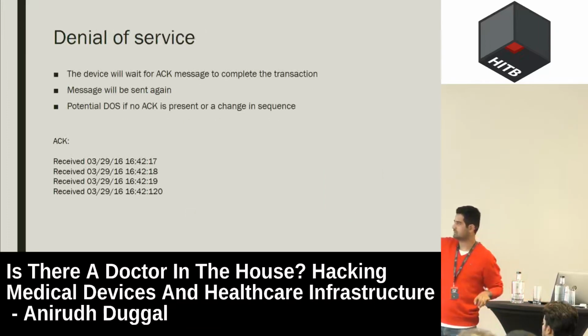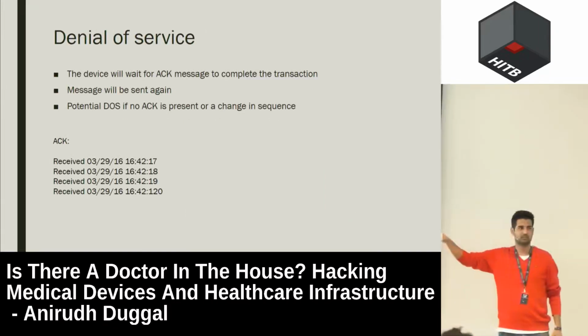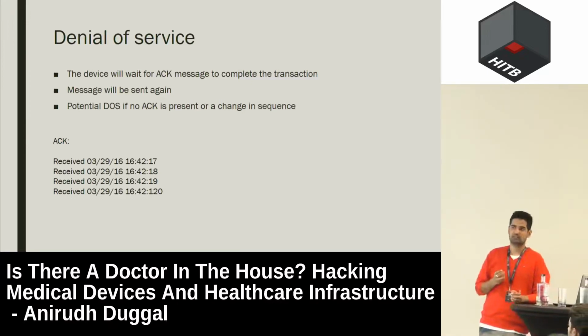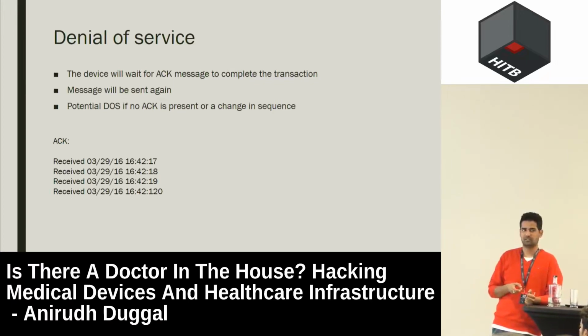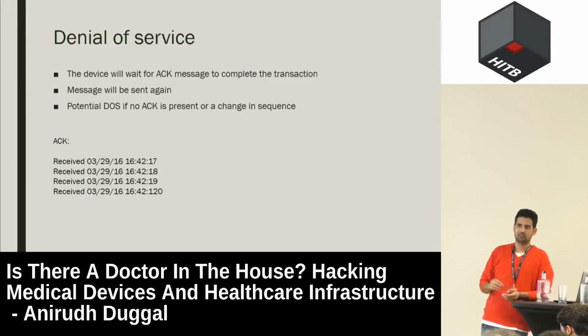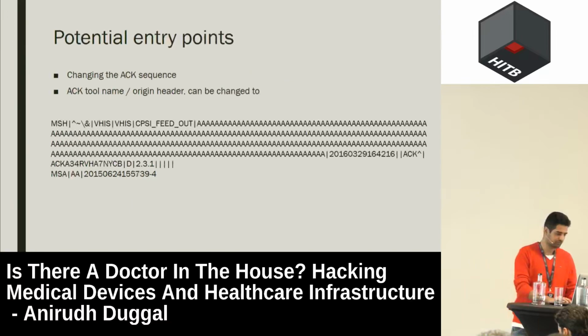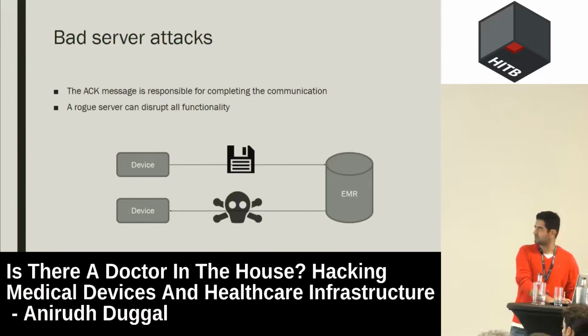Something like this. If it gets an acknowledgement like this, AA, which is a blank message, it'll keep sending messages again and again. This was a hack that was demonstrated. It's just scary to show these kinds of hacks, so I don't do that. But the point is that if this guy is sending you messages back, your patient monitor will not honor that. So it will just keep sending all of these messages, and something bad can happen.